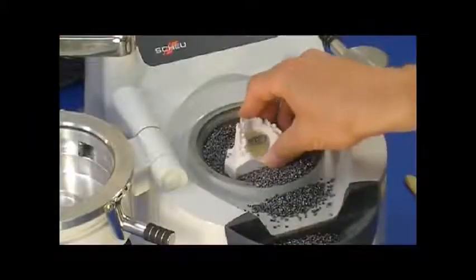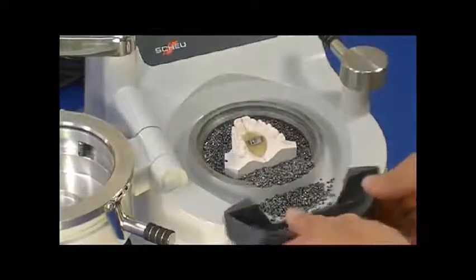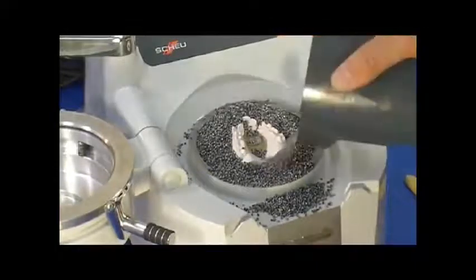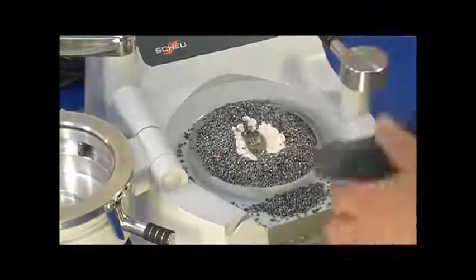The model with screw is placed into pellet cup. Adjust pellet level to align gingival margin to the cup's rim. Apply pellets around model to fill gaps.